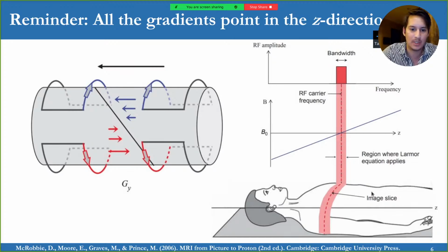And going back to my illustration with the water droplets with radius, you will change the radius of all the spins that are in the same slice. And the other ones will be very out of tune, or they will not hear anything we try to say to them.